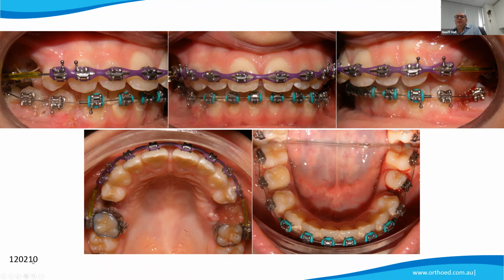12th of February. Oh, so we did this in 2010. Okay. I thought it was earlier than that. Okay. So here we are, braces on. So now all we're going to do is treat this as if it was an upper premolar extraction case, making sure that we look at the anchorage requirements in the upper arch, and our aim for our critical path to success is a class 1 canine. That's really the key now, okay? And we've just got to be very careful of these premolars.